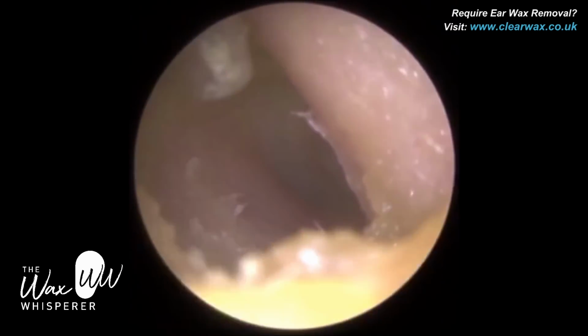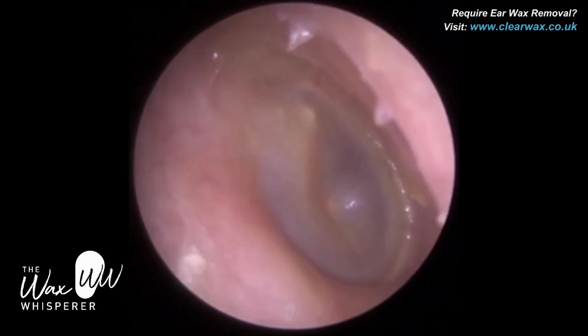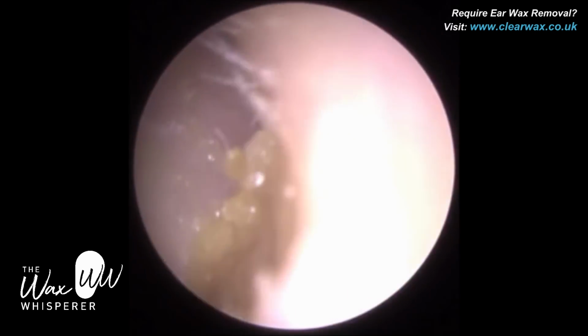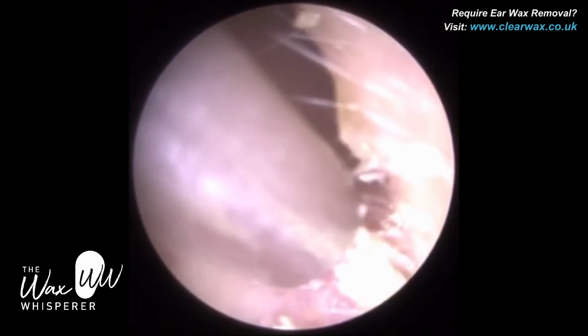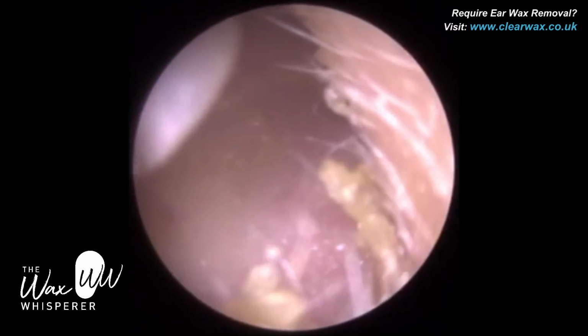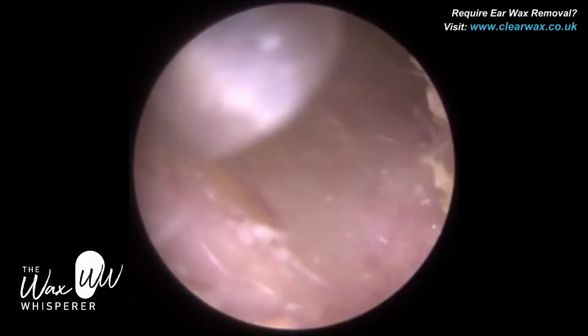In fact, when the patient arrived, I could hear the whistling from outside the clinic door. It was that bad, and so the patient's wife wasn't very happy, and she said, "You must go today and get this sorted." So I've removed the main blockage. You can see the whole eardrum, it's fully intact, fully visible, nice and healthy, and I've removed that sheet, that film of dead skin, dead keratin. So I'm just mopping up near the entrance now.